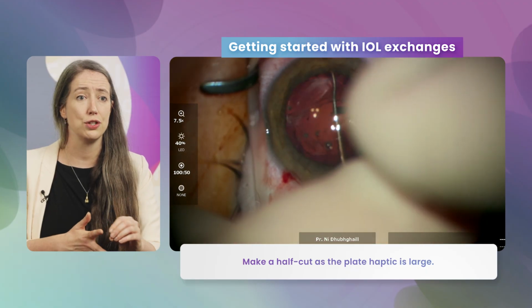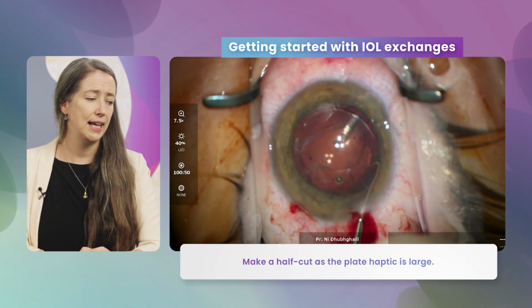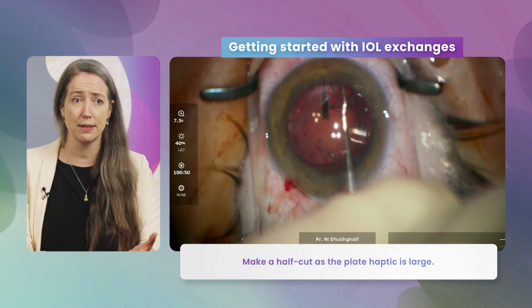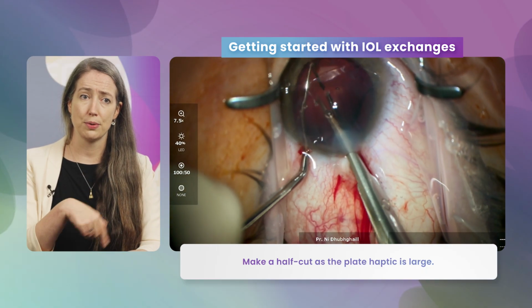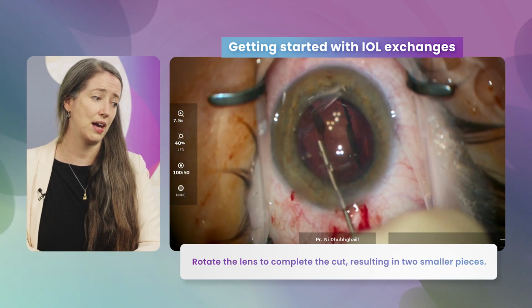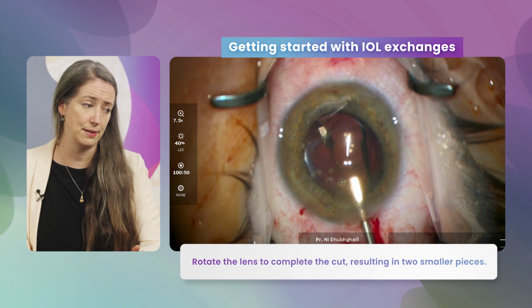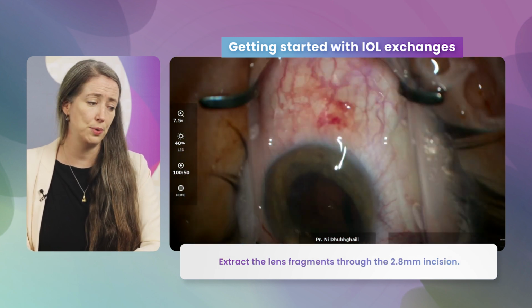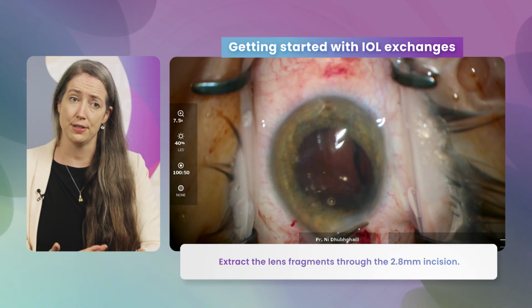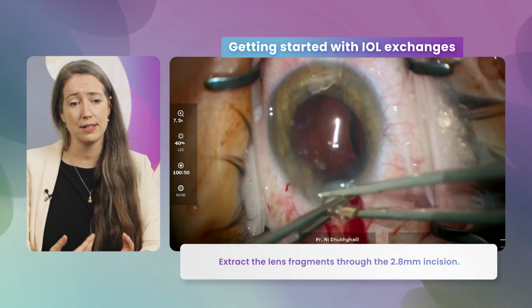Some people have a preference to do a small radial cut, to do a Pac-Man removal. In this case, because it's a plate haptic, it's pretty big, I elected to take a half cut, rotate, and complete the cut from the other side. Then I have 2 nicely mobile, but quite large pieces. This will help me get those pieces out through the 2.8 millimeter incision I've created. And it gives me enough space in the incision to get the new lens in.